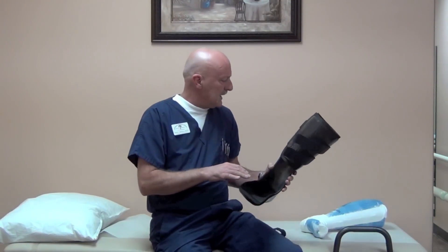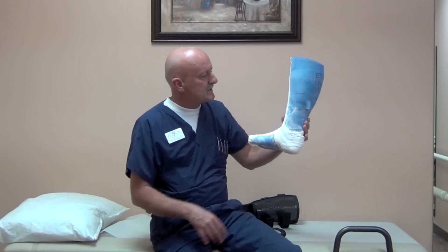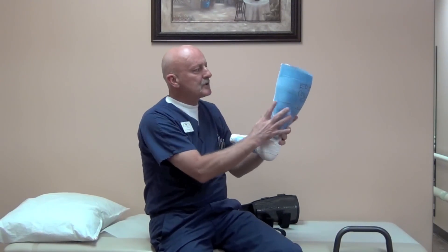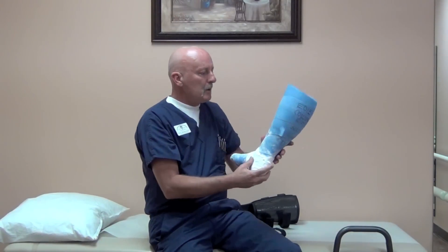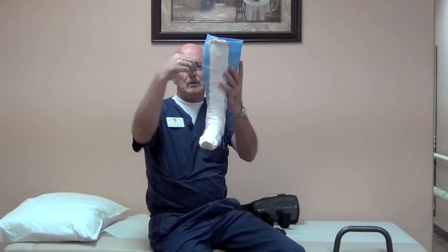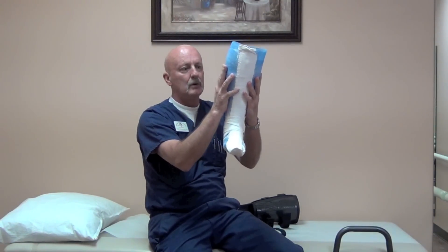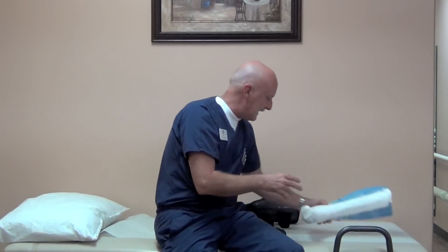How this works is we obtain a cast model of the patient's leg, and then right above the ankle we cut it, separate it a half inch, and then put it back together and pour it so that we elevate the calf structure a half an inch. Because the calf is conical shaped, it cannot drop down beyond the shape contained inside the AFO — in other words, as it gets smaller it will get choked off and weight will be borne on the calf.